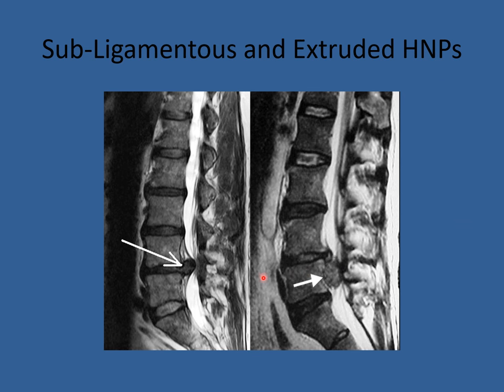There is a difference between disc herniations. Some disc herniations are contained or subligamentous, while others are extruded and have no boundary. Here is a tear through the posterior annulus with a disc herniation, but you'll notice the posterior longitudinal ligament is stretched — this herniation is contained within the posterior longitudinal ligament. Versus this: an irregular ragged piece sitting free-floating in the canal, torn through both the posterior annulus and the posterior longitudinal ligament. This is a free fragment or extruded disc herniation.